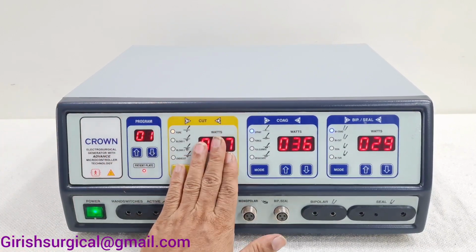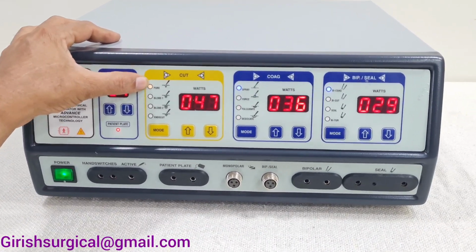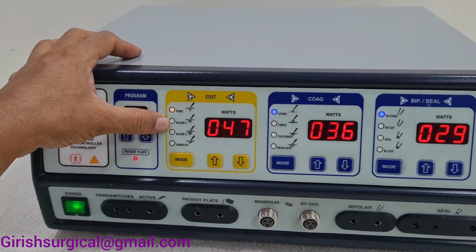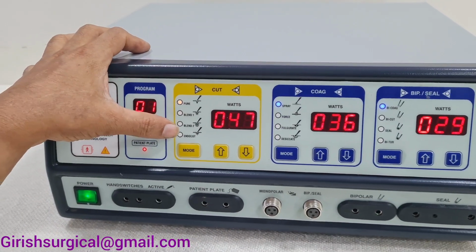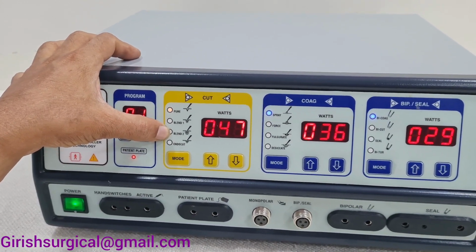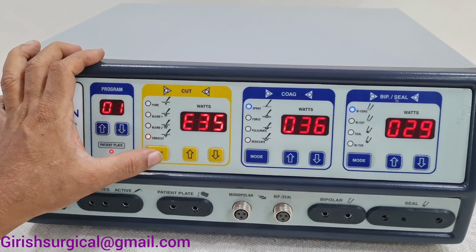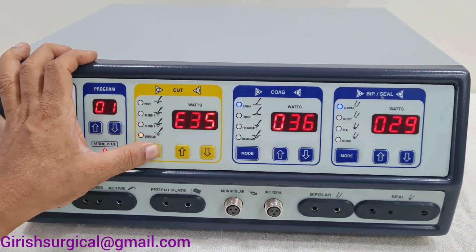Secondly, there is the cut. In cut you will be getting Pure, which means the cutting will be 100%. In Blend 1 you will be getting 70% cutting and 30% coagulation. In Blend 2 you will be getting 60% cutting and 40% coagulation. Endocut is for underwater use. This is the mode button from where you can switch to Pure, Blend 1, Blend 2, Endocut.